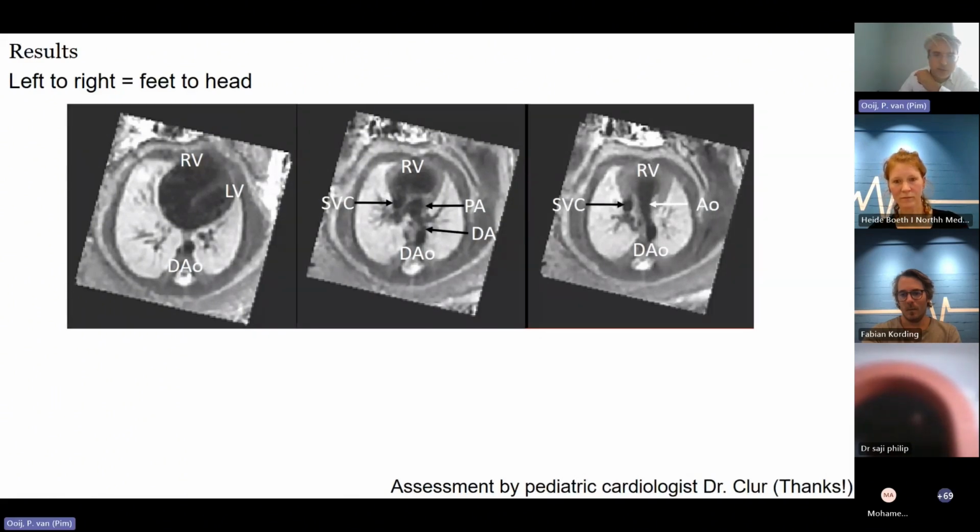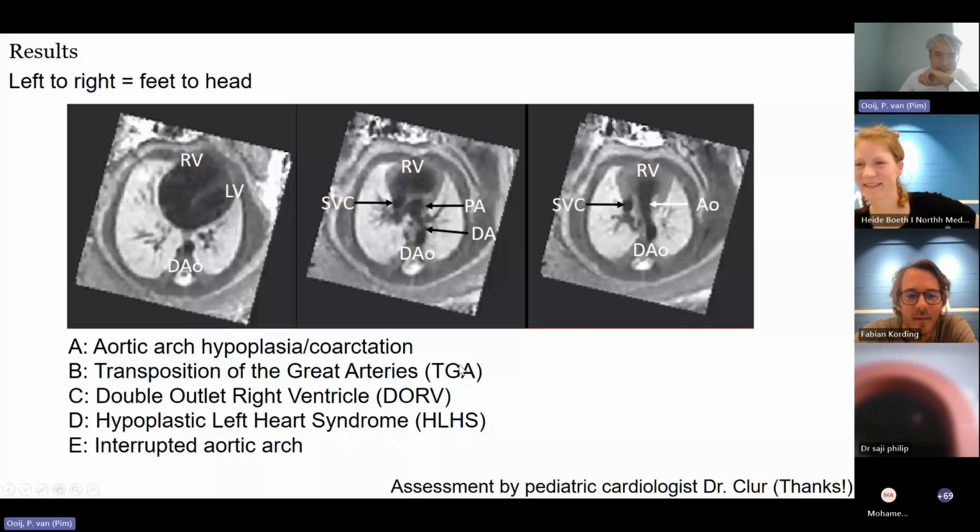So I'm going to vote the right answer here to be able to see what you guys voted. Ah, there we go. Thanks, Sally. Yeah, I know you know the right answer, so maybe you're not allowed to vote. I see 64% voted for TGA, and we think that that is what that is. So let's go to the next one.